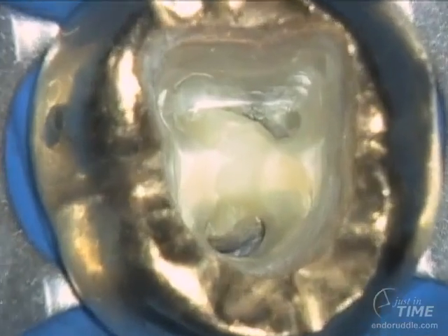If we use the Zeiss Pro Ergo, we have pistol grip handles that allow us to zoom in on the field of action. Whether you're using a Global or a Zeiss, a Seiler, or any number of microscopes that are available today in the marketplace, we would all agree they bring something very important to the game of access preparation.